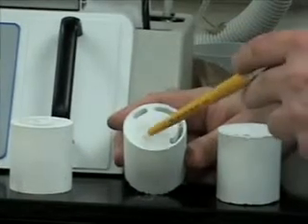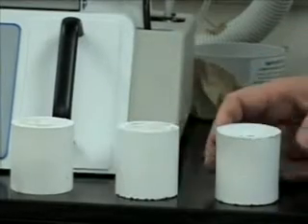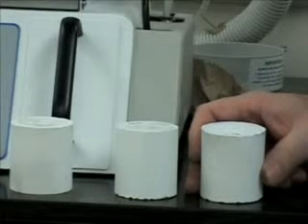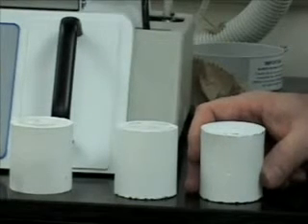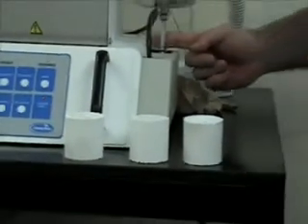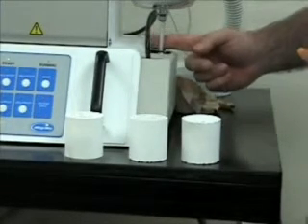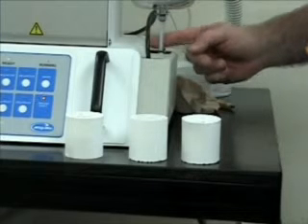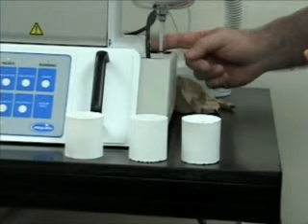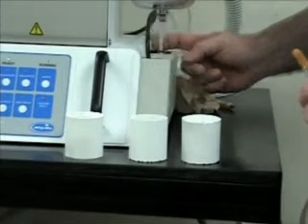If the spindle is turning, then the cause of these types of artifacts is undoubtedly moisture in the beads interrupting the bead flow. And you can also detect this by initiating a cycle and placing your finger behind this front tube and looking for air bubbles or a lack of beads in this front tube. If you see any missing beads or air bubble type phenomenon in this front tube, that also is an indicator of moisture in the beads interrupting the bead flow.